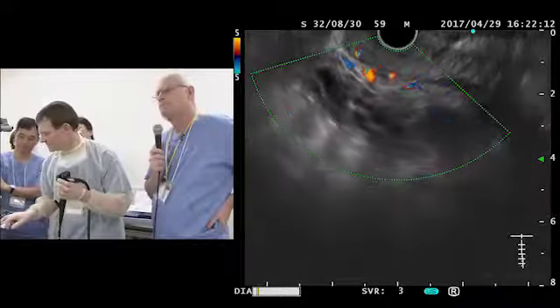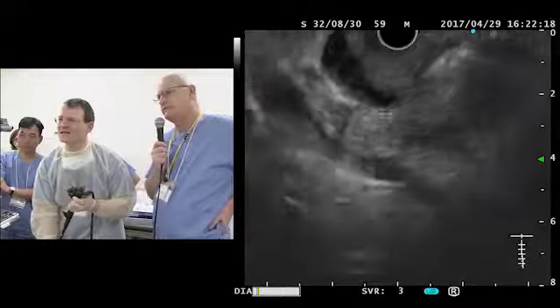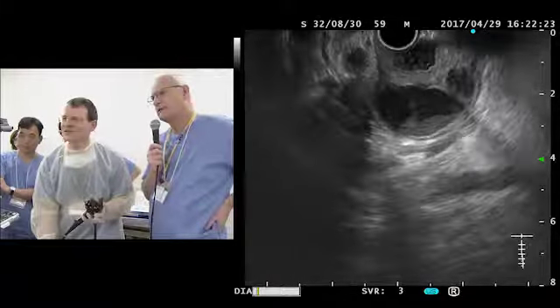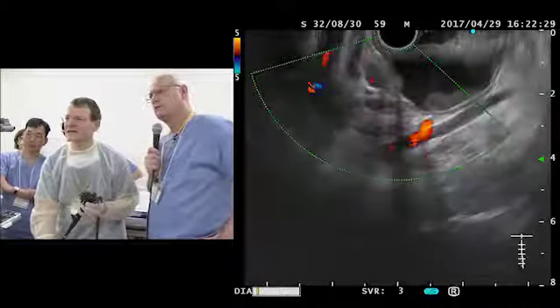Okay, so what is not clear here, where is the bile duct, to be honest? If the bile duct is very, very small, it can be quite difficult to pick up. I talk now a little bit in this direction. Yeah, maybe that's the bile duct there.